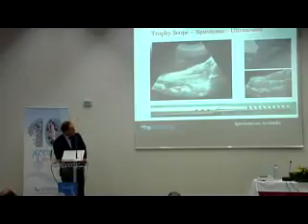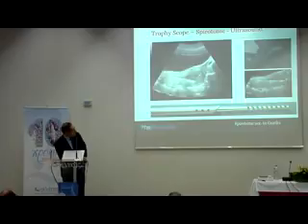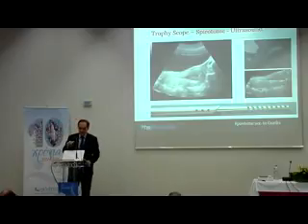So what do we have? We have a corkscrew with a cutting device. And as you see in MRI, the posterior wall is total loss of function. So we'll take 2 biopsies, and now we are turning the corkscrew into the wall, and we go until the serosa. But we see it in ultrasound, and only when we're 100% sure, we make the cut.